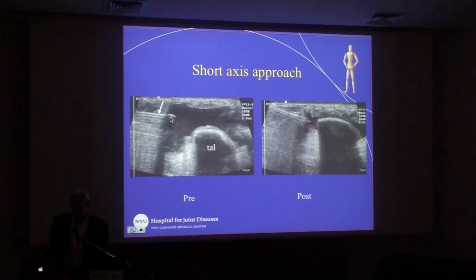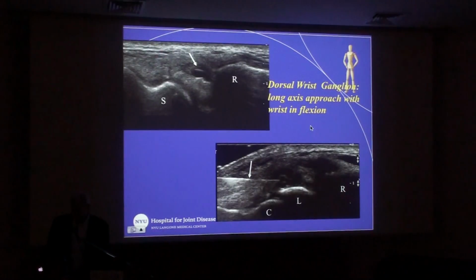And this is fairly easy. I mean, this could probably have been done clinically, but you can see very nicely our needle going in, a reverberation artifact, and then since we're looking in real time, we can watch the cyst diminish in size, and I may leave a little bit of steroid and anesthetic in that.